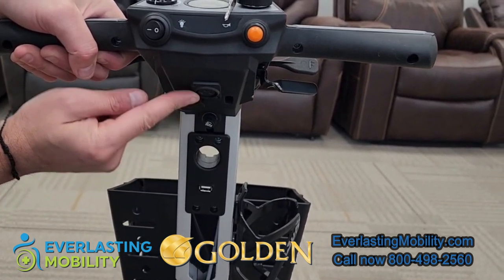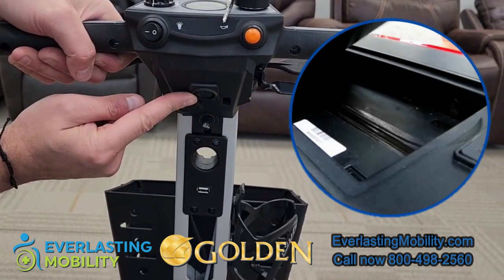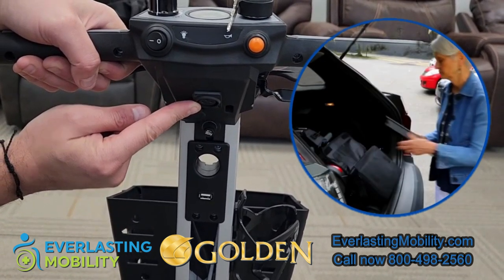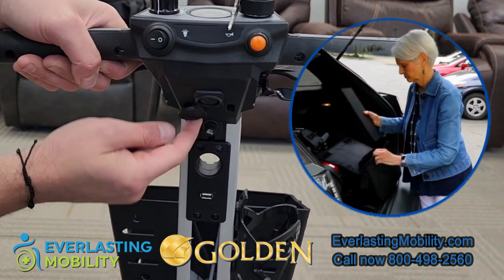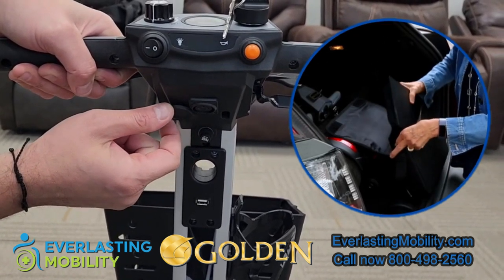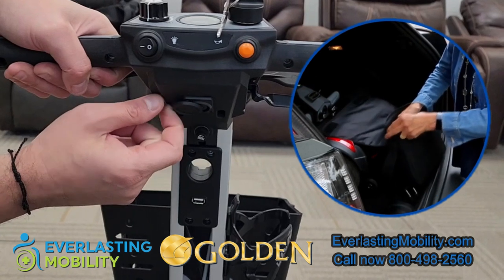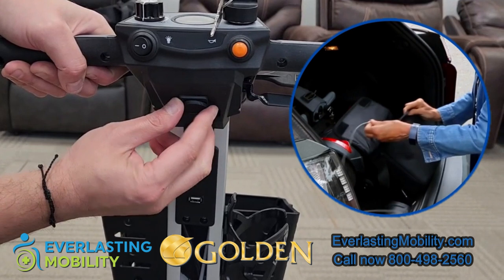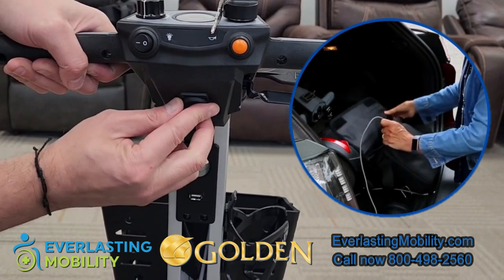Alternatively, with the newer models of the Buzzaround Carry On, when you remove the battery there is a charging port on the battery itself — that's a new feature they have added. You can charge the battery inside your home, and once it's fully charged you can take it outside and put it back on your scooter so you're ready to go.